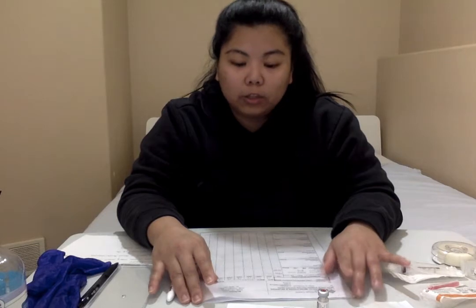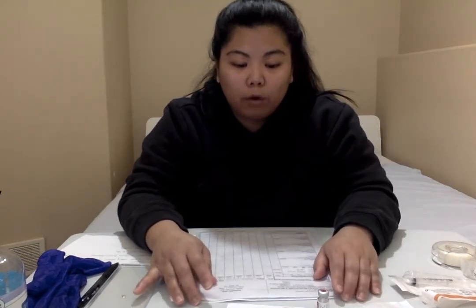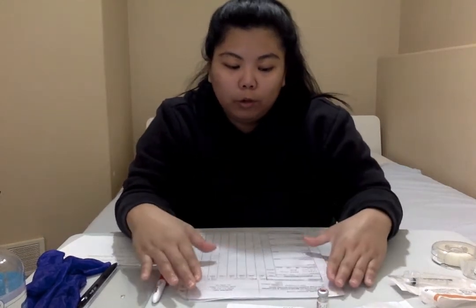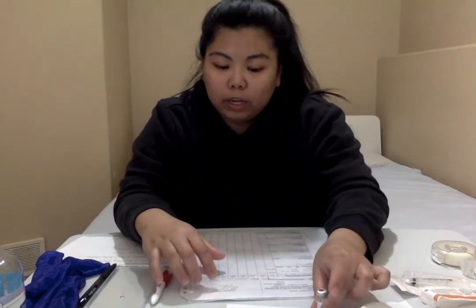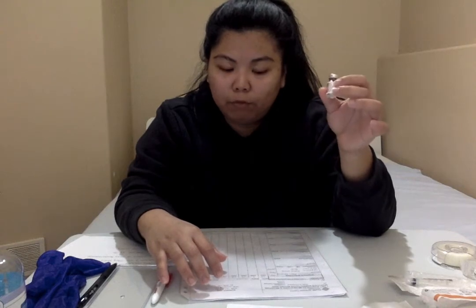So my patient is currently unable to ambulate, so that's why this medication, heparin, is given as a prophylactic treatment for DVT, which I have no concern for. That is appropriate. So we're going to go ahead with our first check. So what I'll do is I'll compare the MAR against the medication label on the container I have pulled from our supplies.